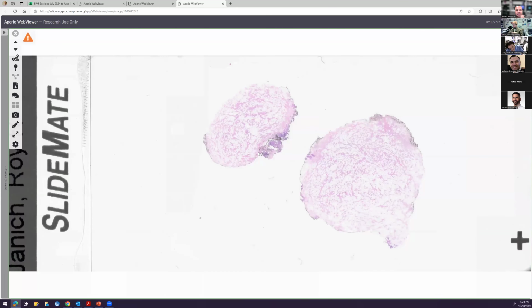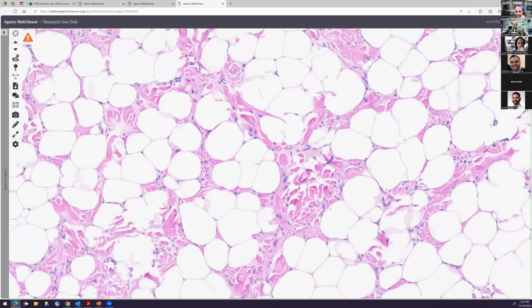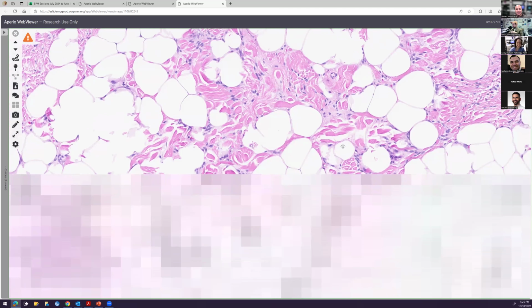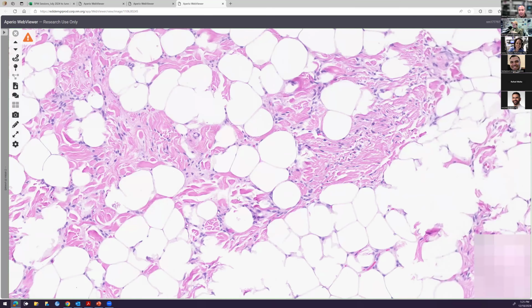I think I have another example over here for you. This one showing nice big bundles of collagen. Yeah, those are big. This is more ropey. This is more convincing. The last one I didn't buy. Getting denied. But yeah, so again, bigger bundles of collagen here. The other one was a little bit more cellular.